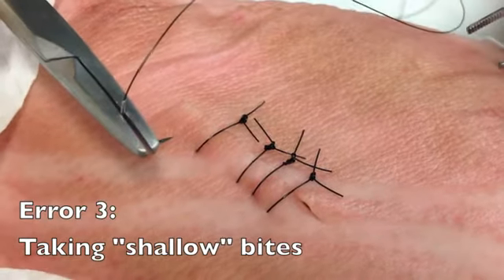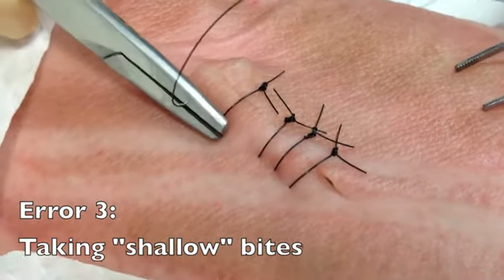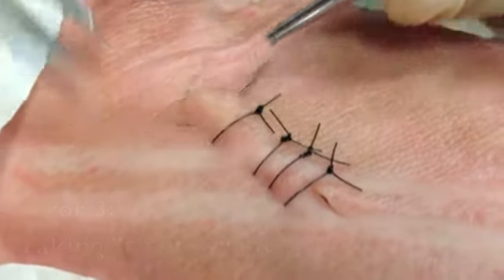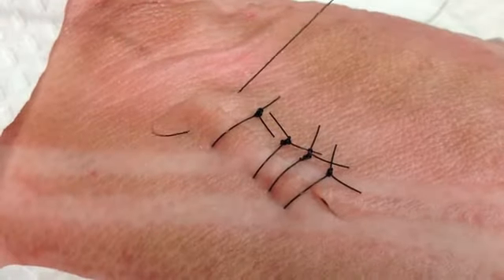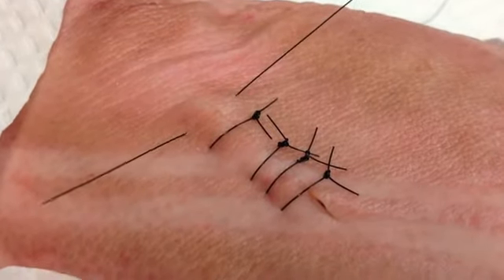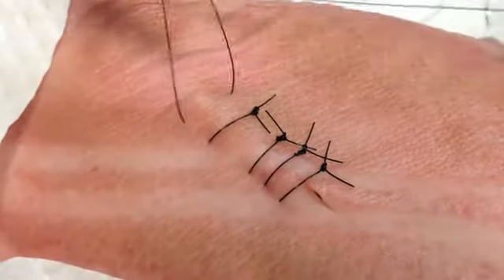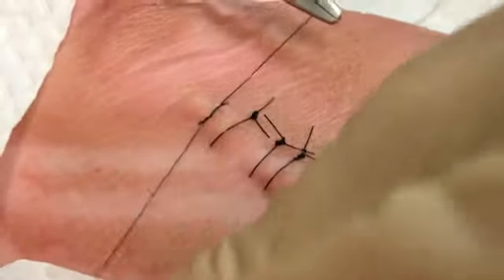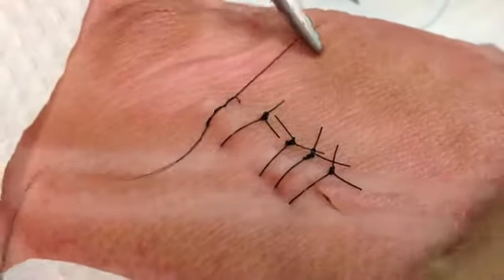And the final common error is taking too shallow of bites when you're doing your suturing. What you want to try and do is make sure that the depth of penetration is actually wider than the margin of the length of the wound. If your depth of penetration is too little, what you're going to end up doing is taking a shallow bite. And the problem with this is you're not going to get that wound edge eversion that you're looking for that's going to help the scar to flatten out as it contracts down as it's healing.